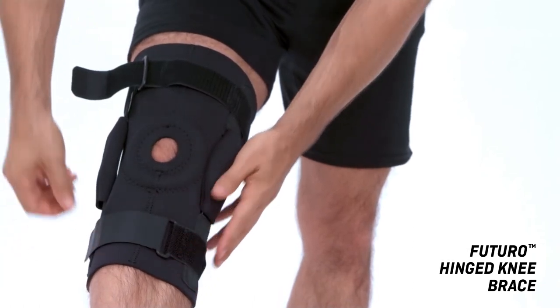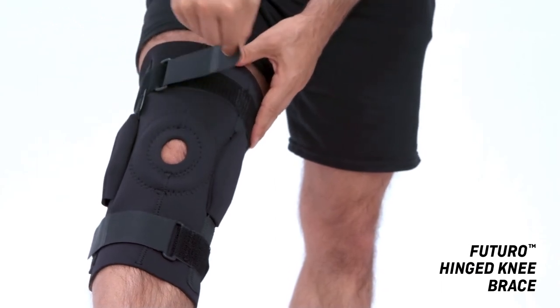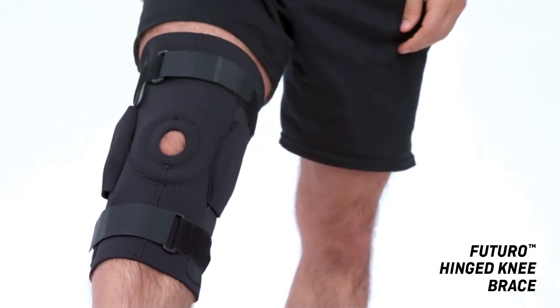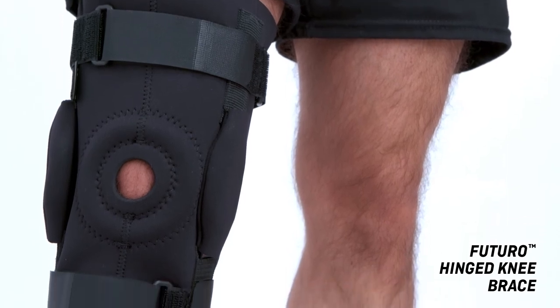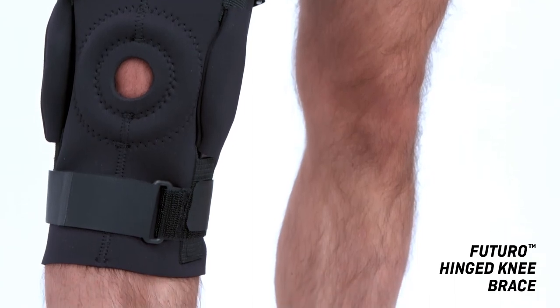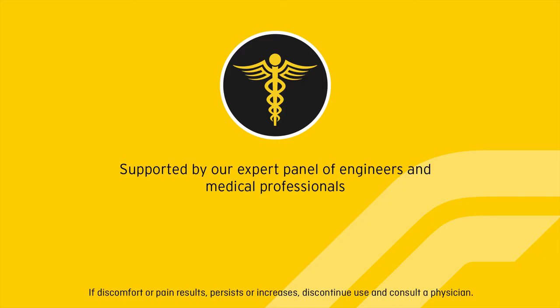For additional support, adjust all closures until fit is firm yet comfortable. Ensure the side hinges remain along the midline of either side of the leg by use of the strapping system. Futuro hinged knee brace is supported by our expert panel of engineers and medical professionals. If discomfort or pain results, persists, or increases, discontinue use and consult a physician.